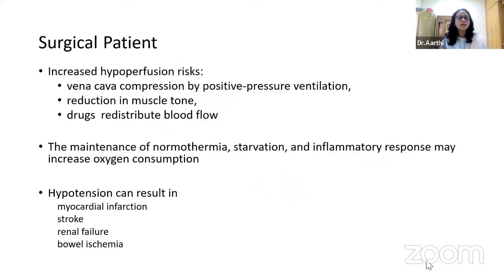Appropriate and early application of diagnostic information from hemodynamic monitoring has been shown to reduce mortality in shock. Coming to surgical patients, we talk about a lot of hemodynamic monitoring in critical care patients, who are critically ill with multiple reasons for circulatory dysfunction and extensive comorbidities.